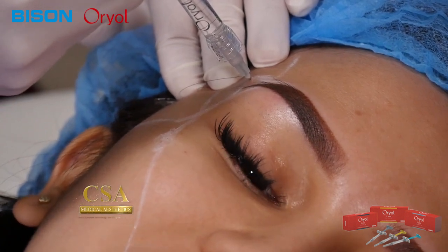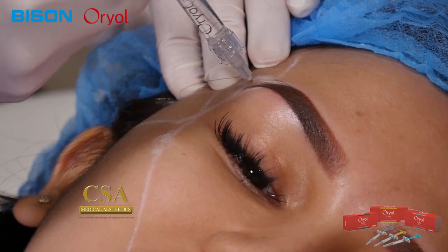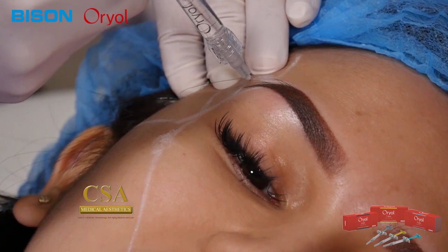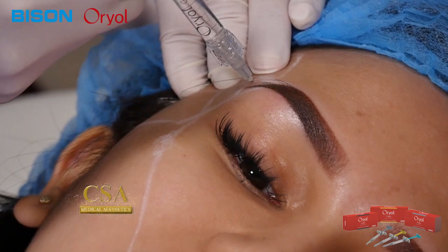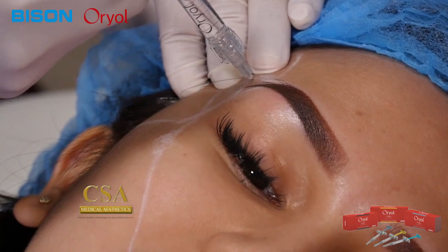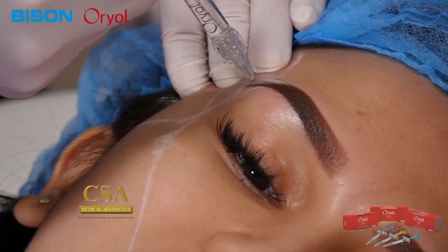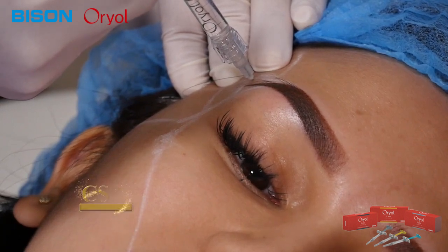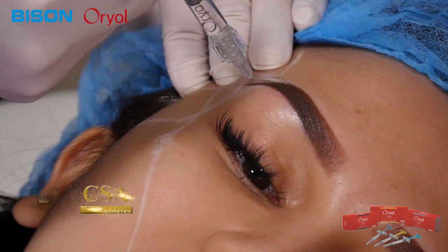Okay. So the good thing with the product is it's a hyaluronic filler with lidocaine. So it has lidocaine incorporated in it. So we're just pushing in slowly until I reach that 0.5 mark there. And almost, I just need a 0.1 to complete my product. Okay, so we're working on the temple region.